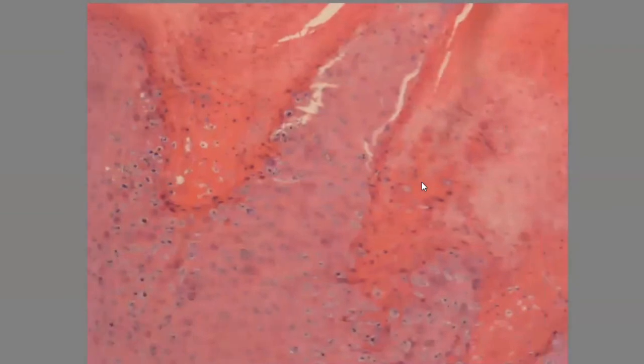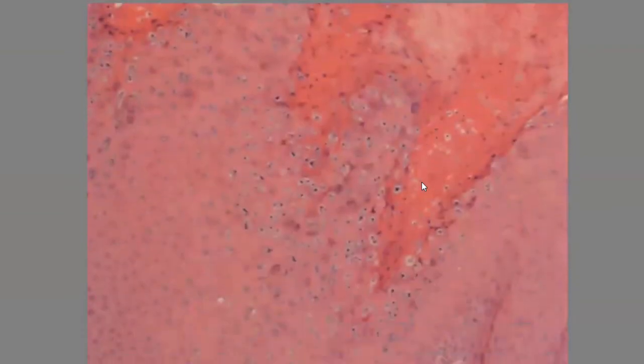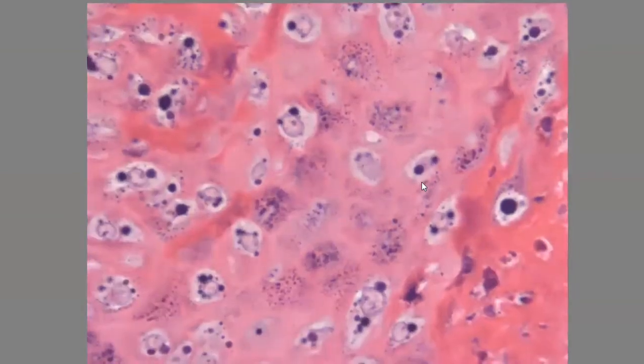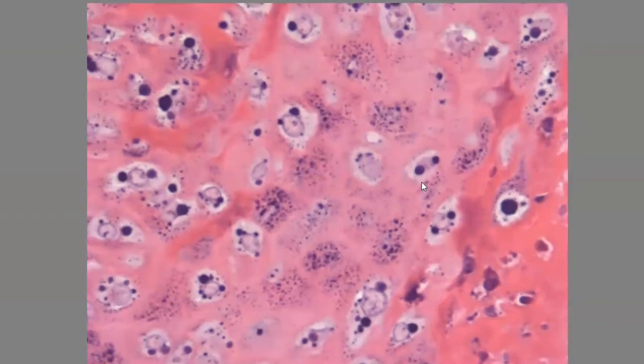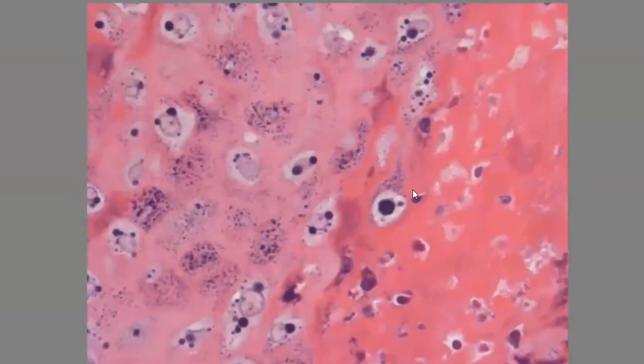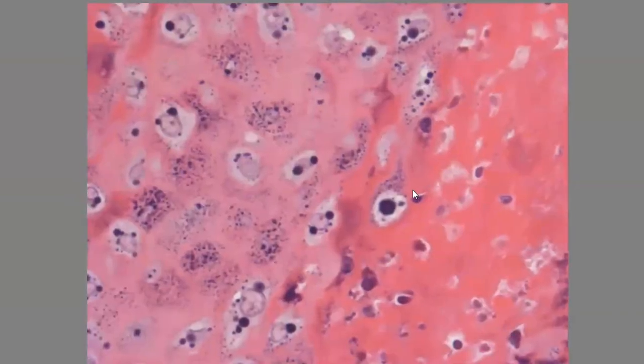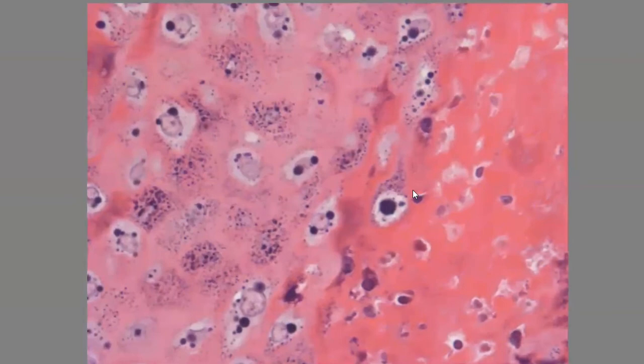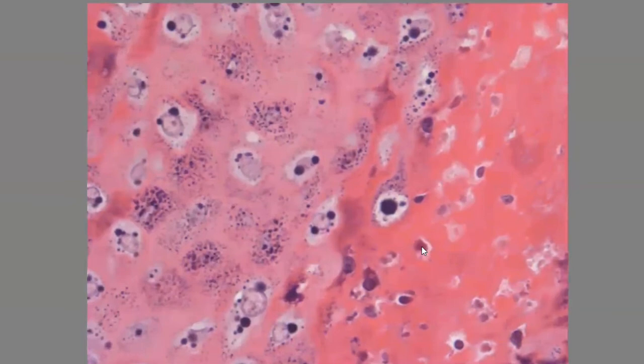So this is the 40x, and I hope now you can appreciate these clumps of innumerable large clumps of basophilic keratohyaline granules, these granules. And we can also have these eosinophilic granules together with these basophilic ones.